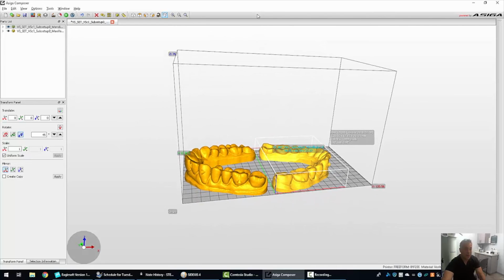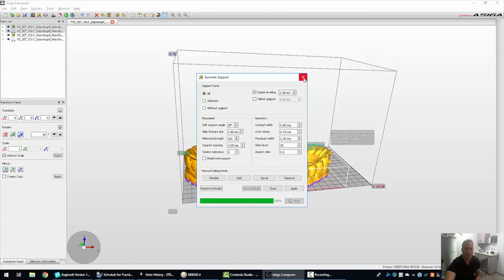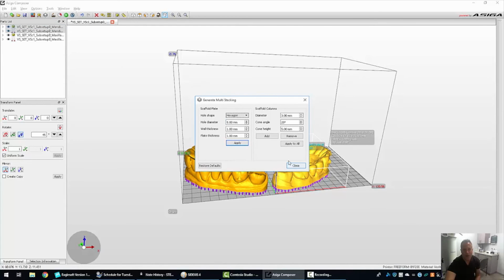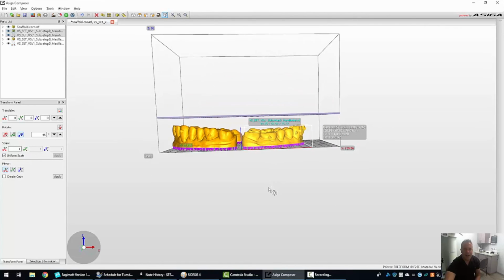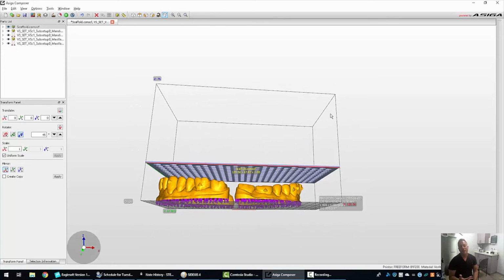Now, one thing that's really pretty cool about Asiga is that it has the option of actually building a little house. So let's go ahead and go on this little house. I think it is called Generate Multi-Stacking. And we go ahead and hit Apply. And you can see here that now we have another platform. Now we'll have to build structures that go underneath that. But you can see here that we can now build another layer and another layer. What that does is it gets over the fact that we have a relatively small build plate. Now look, that's really, really cool.